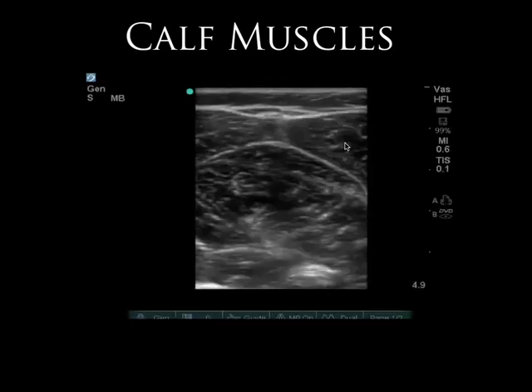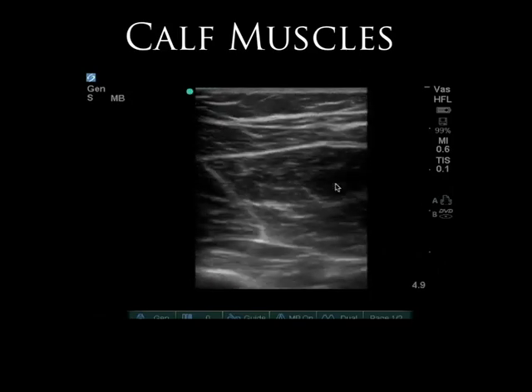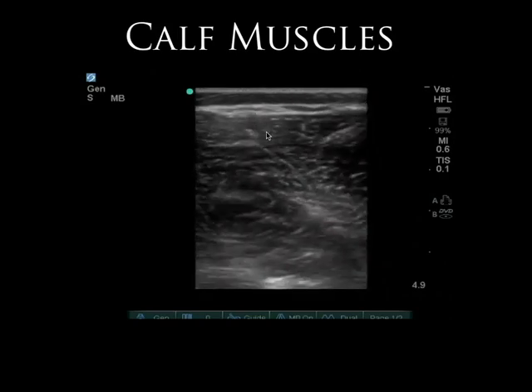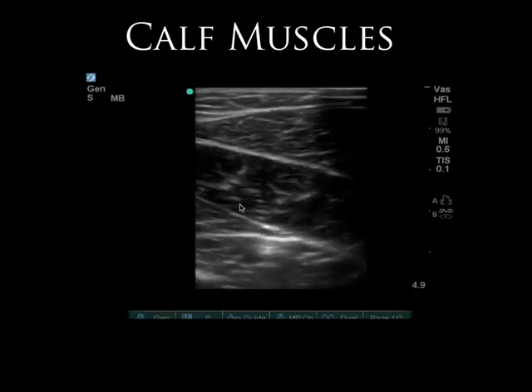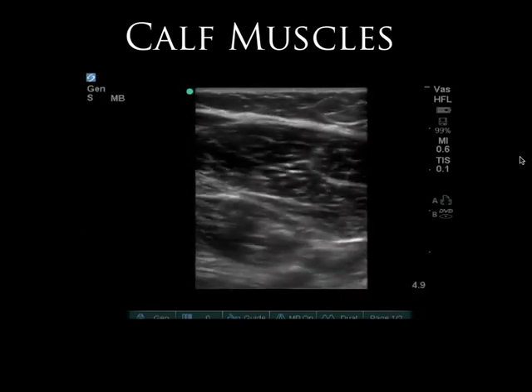And when I use the real-time clip to fan through it, again, the gastroc gets very thinned out. Soleus takes over as we go distally. Now we're going more proximally. Gastroc gets bigger, the two bellies of it there. Gastroc, soleus down here. You can really make out those two completely separate muscles quite easily on ultrasound.